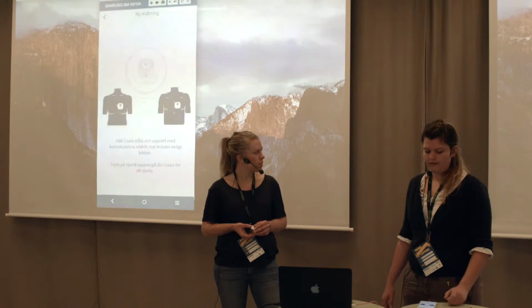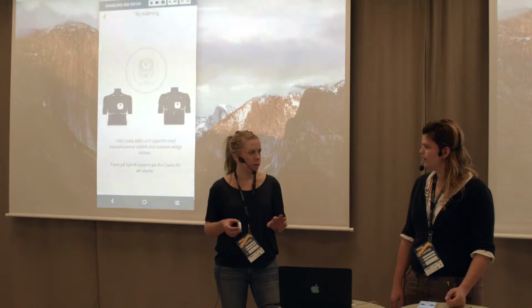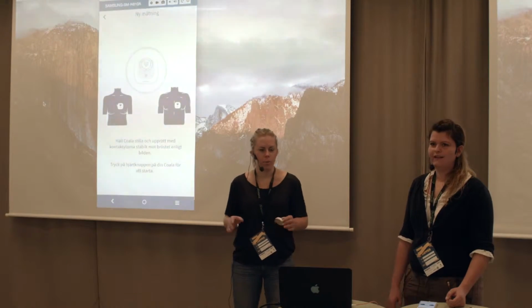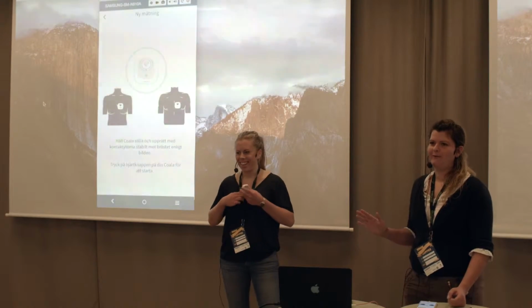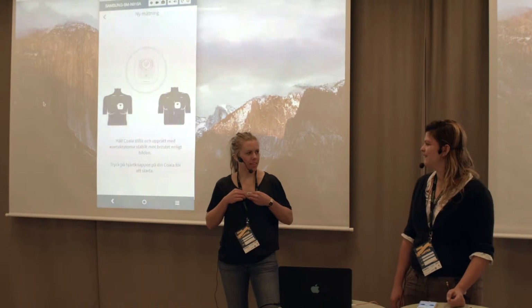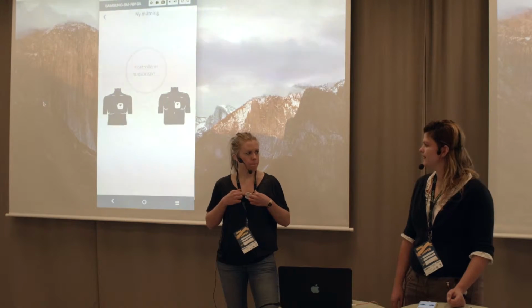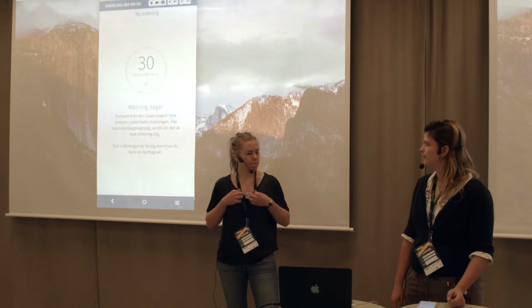We will start with the chest measurement. It says there that you should be really calm and sit down. This is like the opposite. This is not the optimal situation for recording your heart, but let's try it. I'm going to put it here, then I press the button, and it checks the skin contact and will start recording.